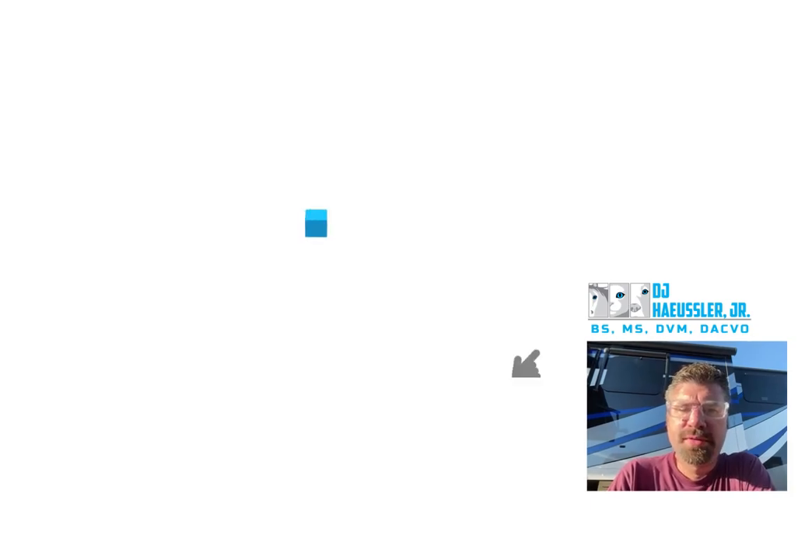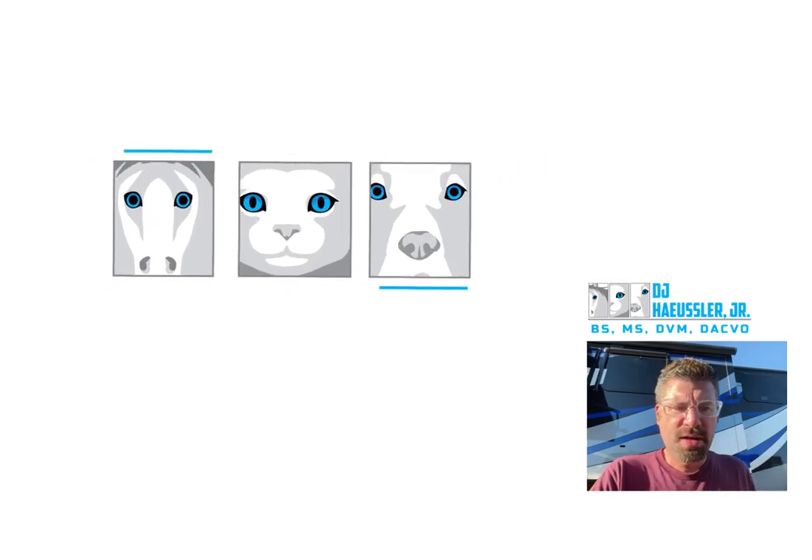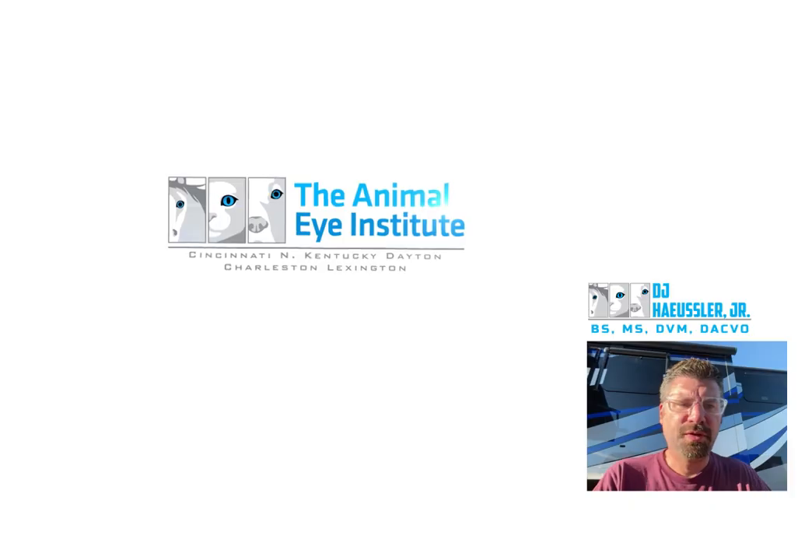All right, here's the next conch craft. This is again in two and a half times speed, sped up a little bit for efficiency.